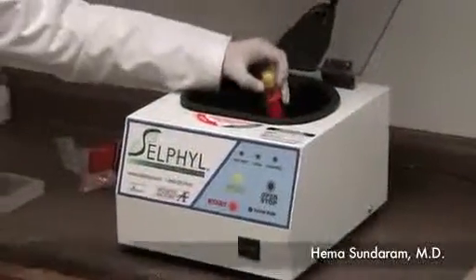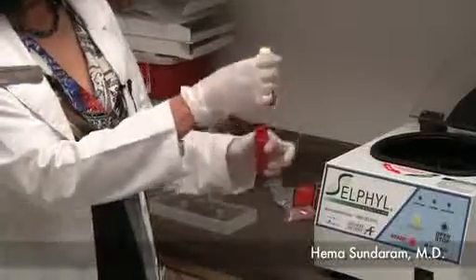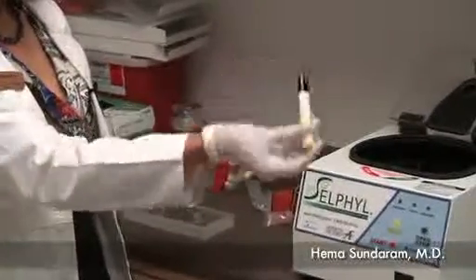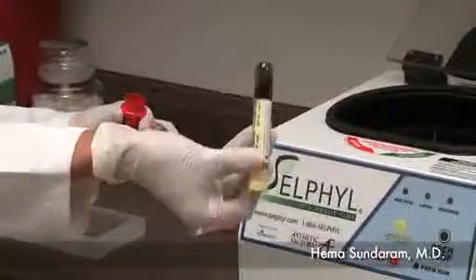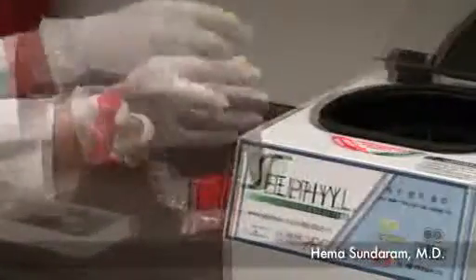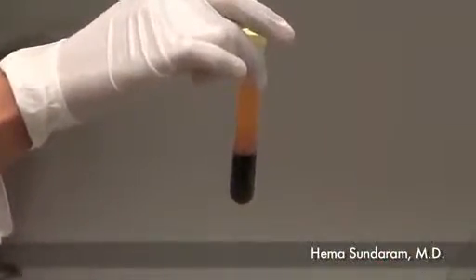The tube of blood has now spun for 6 minutes. And I'm going to invert it 10 times again. And you can see that the red blood cells and white blood cells have been separated out.